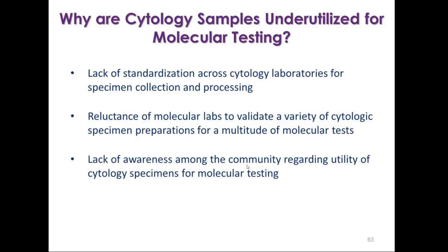There is also the lack of awareness in the community. I mean, there are countless times when you're doing a procedure and the radiologist comes in and asks you, oh, I didn't know you could do that on an FNA. So there is a lack of awareness, and so it's up to us to increase that awareness in the community.